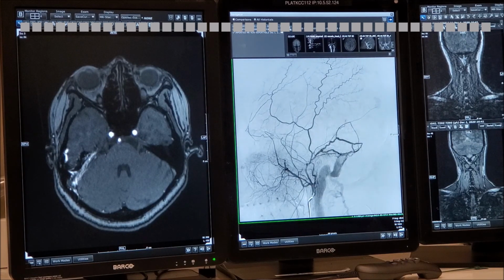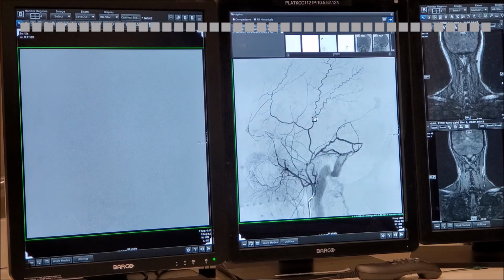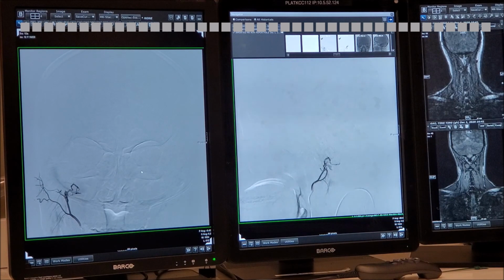So go back to the angio. What's going to be your next injection? We're missing the occipital. The occipital. Okay, yes, the ascending pharyngeal, you know I like her very much. She's a beautiful artery. So wait, what did you get here? What artery? I think this is posterior auricular. That's posterior auricular, yes, and you see how indirectly it comes to the fistula.